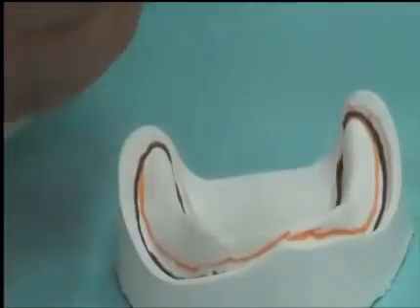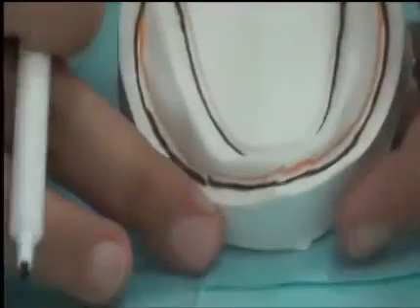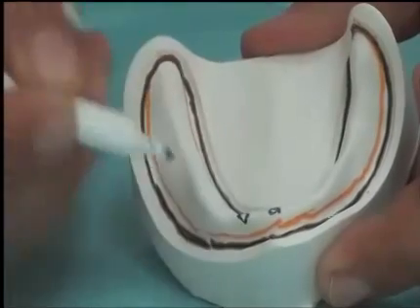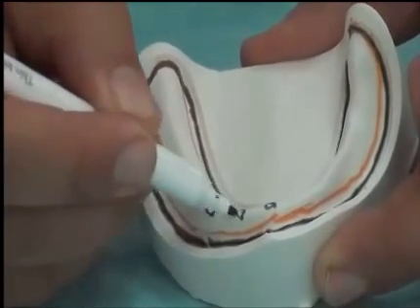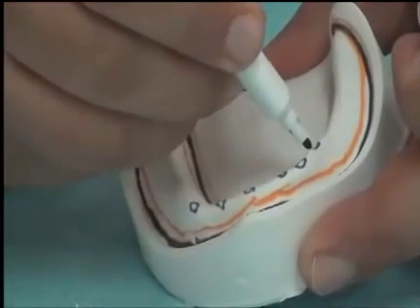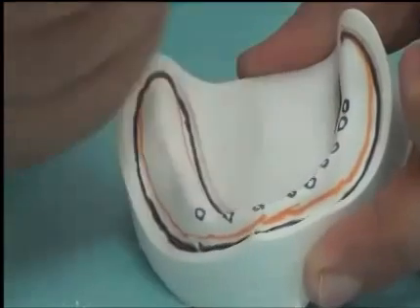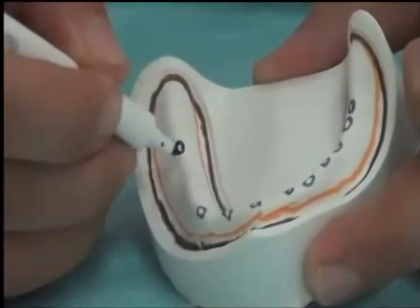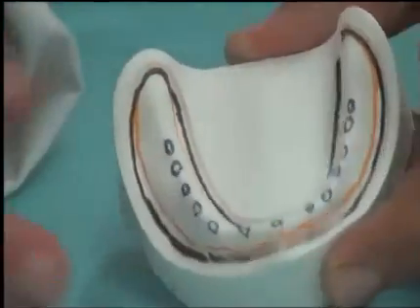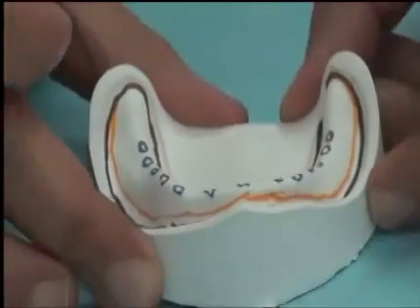But then, once we have our material ready, we are going to place holes in the areas where we need to have relief. So the holes in the tray will be over the canine eminence, over the crest of the ridge anteriorly, the canine eminence on the other side, the crest of the ridge, excluding the retromolar pad. The retromolar pad should be compressed in denture impressions. So we can apply these holes in the tray once it's there.